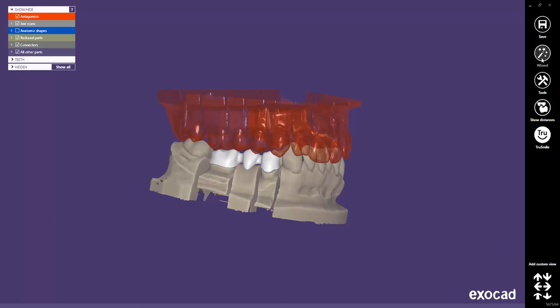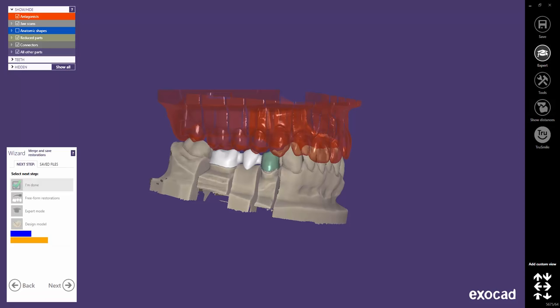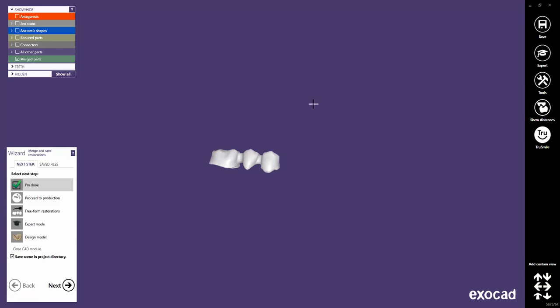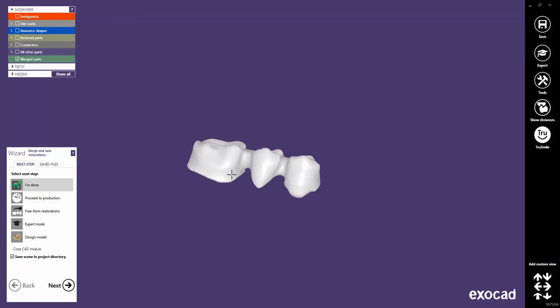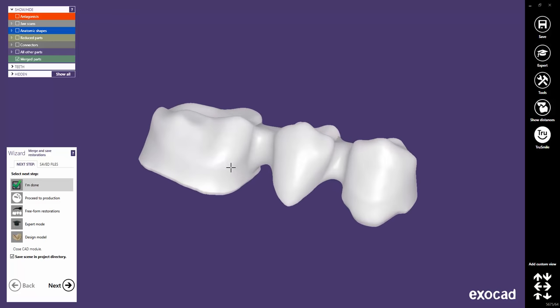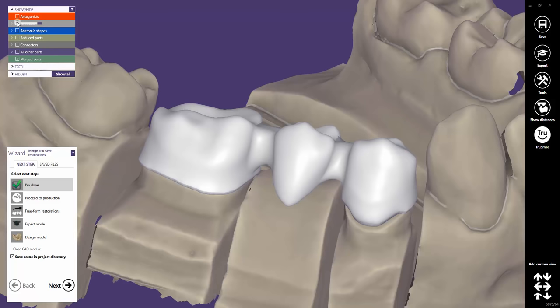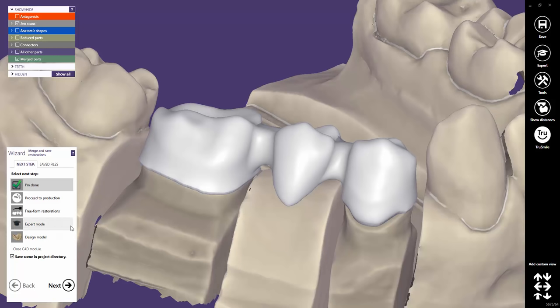Simply restart the wizard to export the restoration with the new parameters. Click on I'm Done to close and save the scene.